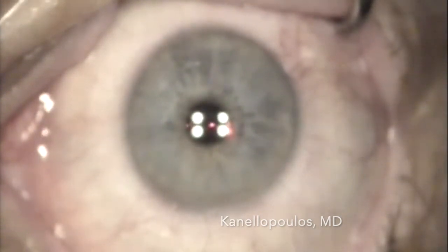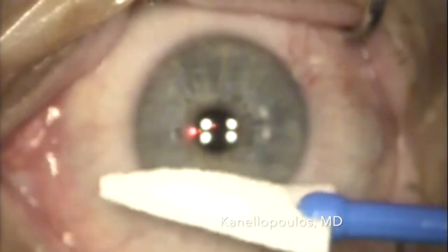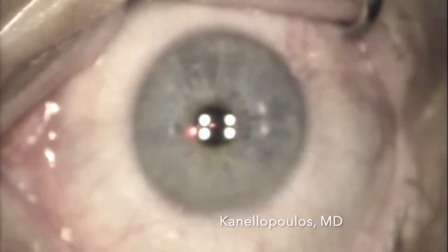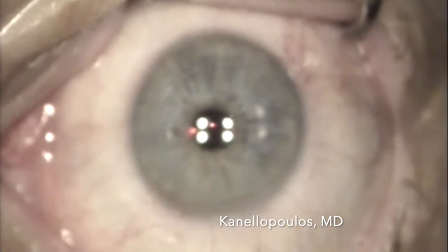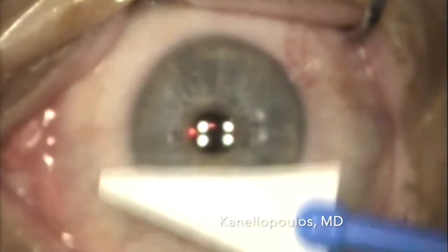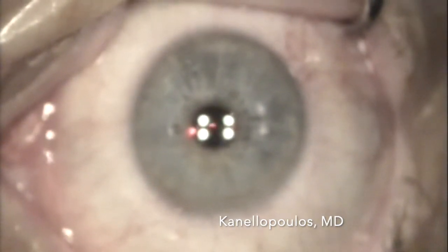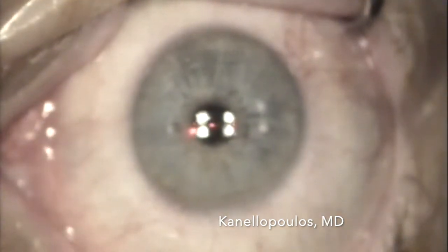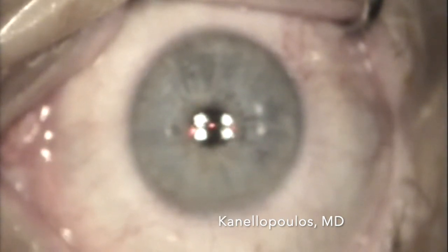We're going to calculate — and here's the eye of this lady under the EX500 excimer laser by Alcon. We're trying to equilibrate the hydration of the surface, not dry it too much. We calculated how much hyperopic correction is needed to match those 50 microns of epithelial removal, and we added it to the hyperopic correction we want to treat in the stroma. We ended up with a plus 2.75 correction added to the two-diopter hyperopic correction, so we dialed in the laser at plus 4.75.